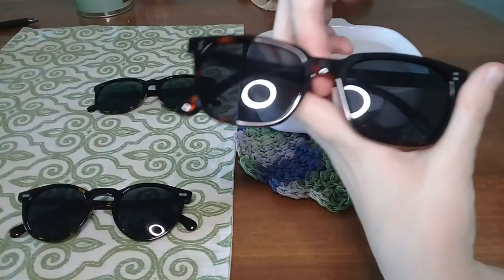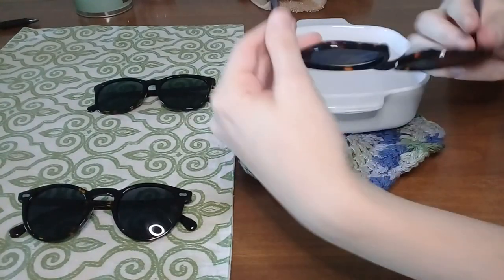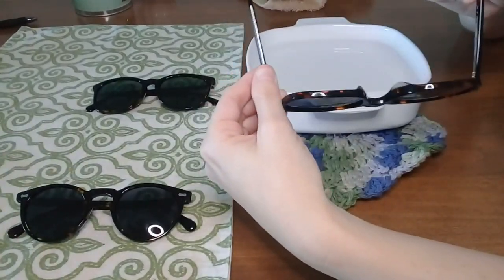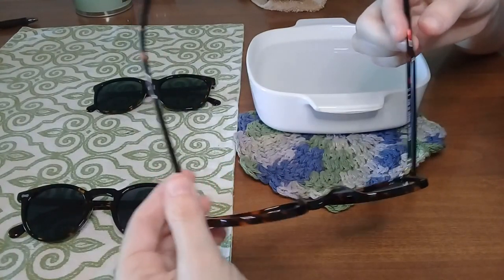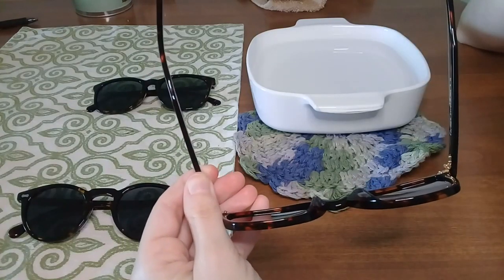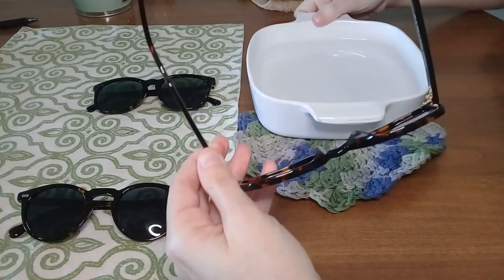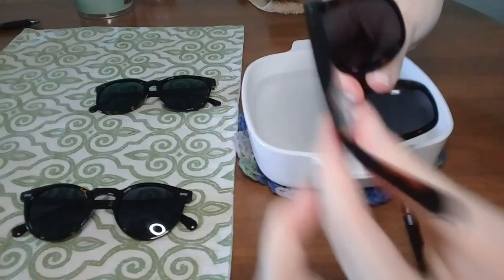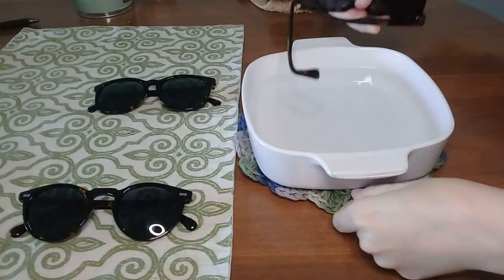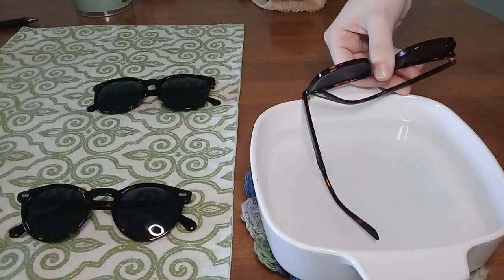The second pair is the classic square. Its particular issue is that it's really wide — the temples are really spread out, and we need them to curve a little more so they stay behind the ears and won't slip off when looking downward. The first thing we're going to do is submerge the temple only where the curvature is happening — put that in for about 15 to 30 seconds, same sort of time frame.